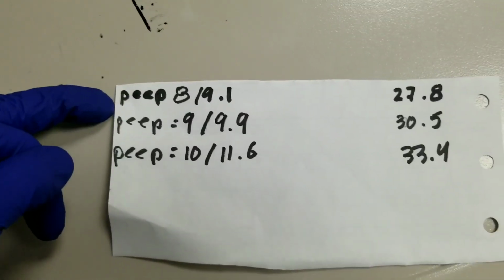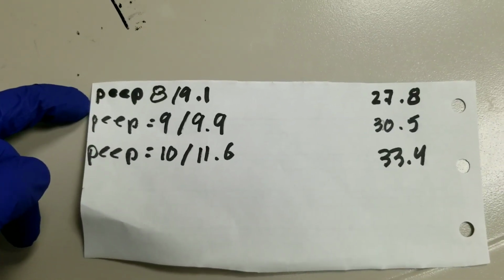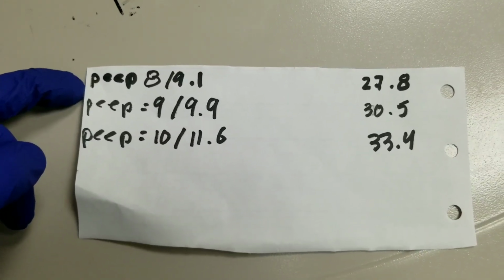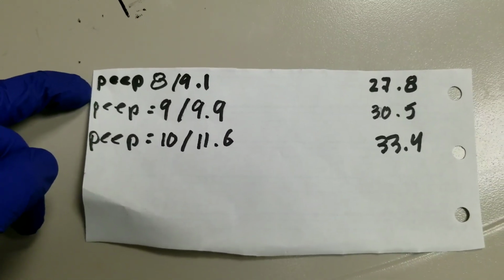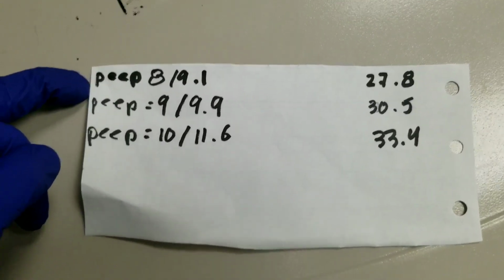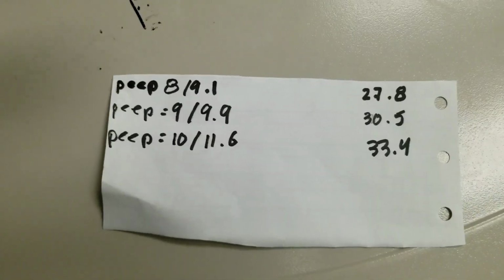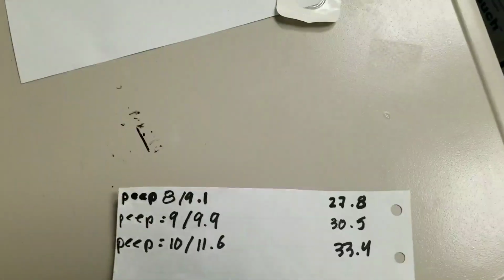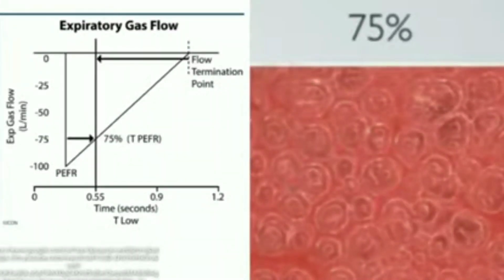So we're going to do the PEEP study, and we're going to check out what the PEEP study says as an ideal PEEP. Then we're going to give a trial of APRV, and we're going to look at the auto release option that allows the patient to expire to a certain percentage, as explained before. So it's called auto release on PC-APRV on the Drager ventilator. Basically, once you're on the P high and you drop to the P low setting, the P low is not set, and the T low is determined all based on the auto release button. So it's expiratory termination and it's a percentage.